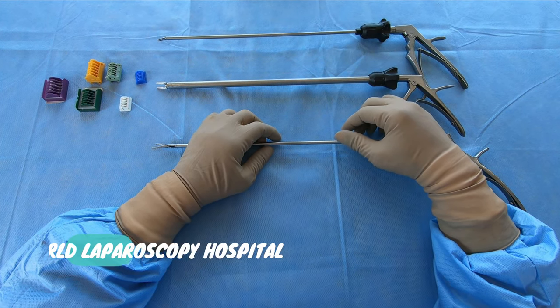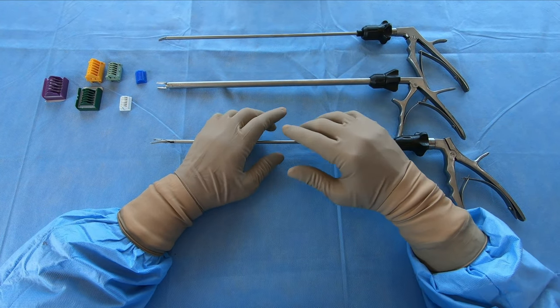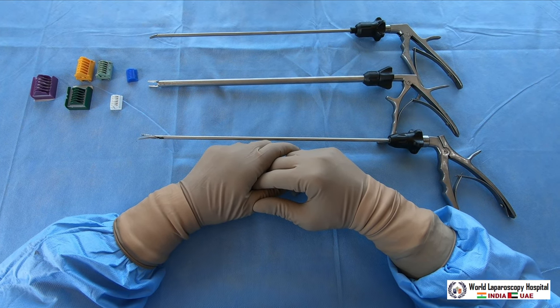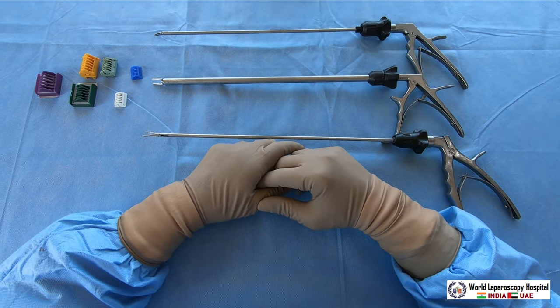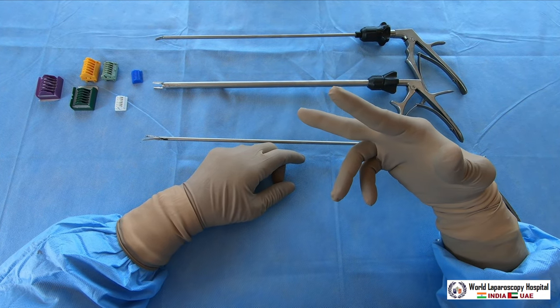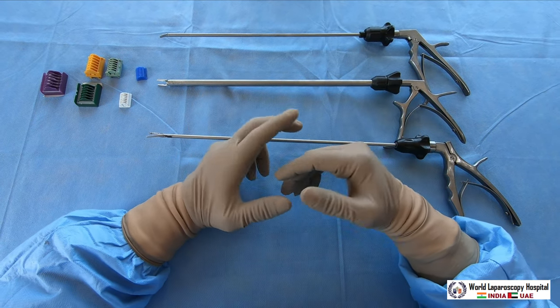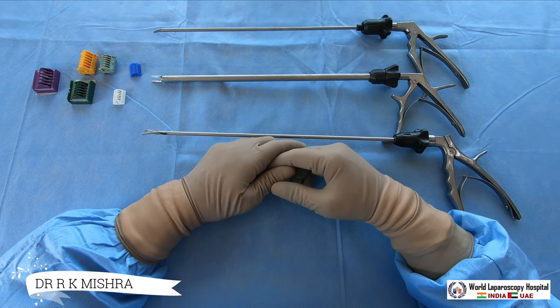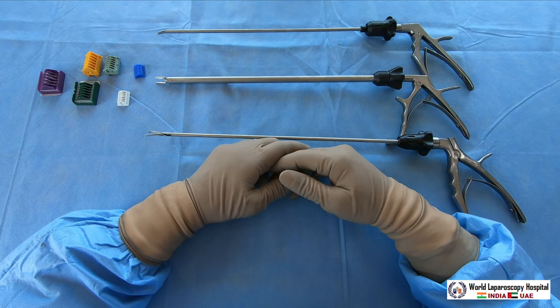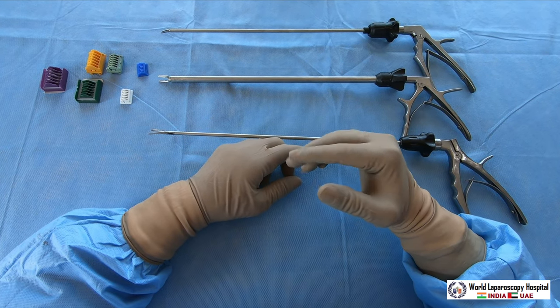Hello friends. Today I am going to discuss the different clip applicators. Clip applicators are very important because in laparoscopy, whenever you have bleeding you can easily use a clip applicator and apply a clip over the vessel to stop the bleeding. Sometimes if you want to do an appendicectomy or the cystic duct for cholecystectomy, you can apply the clip.